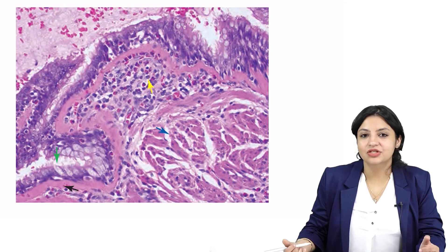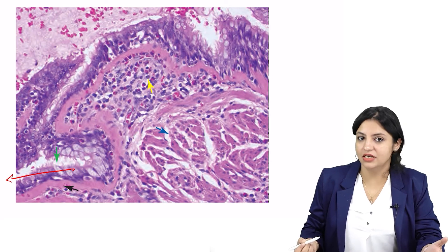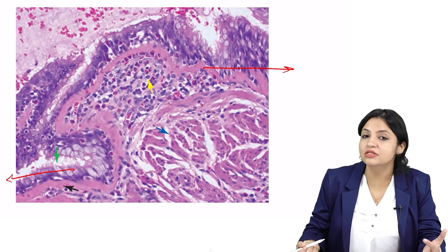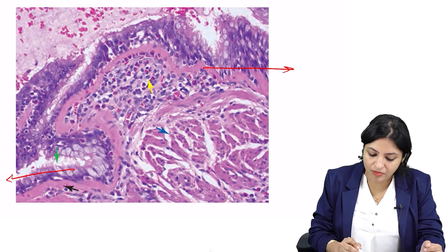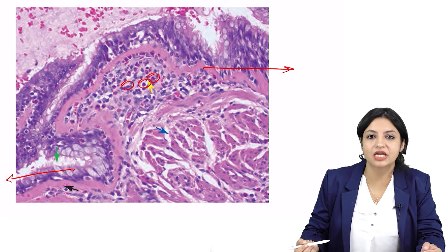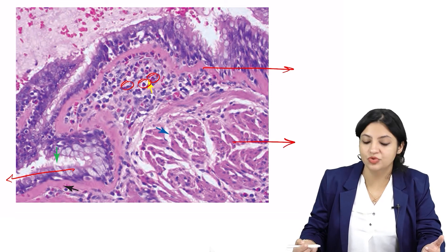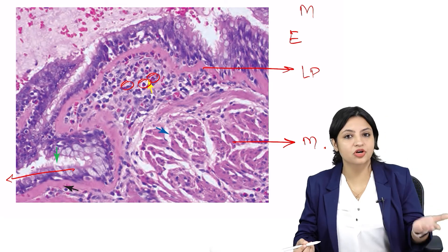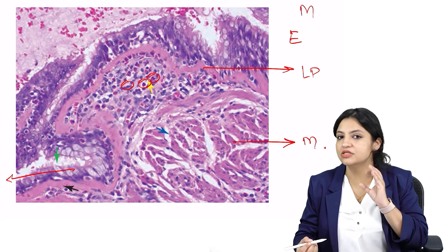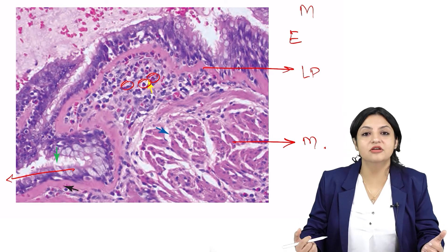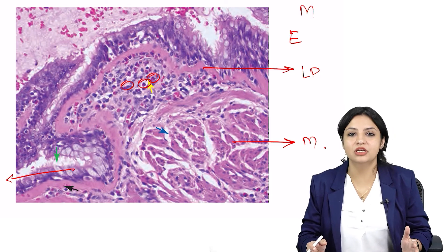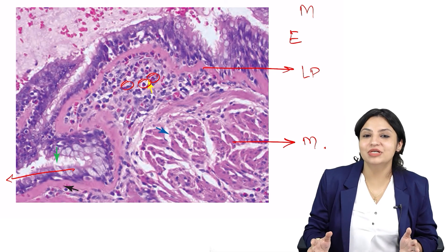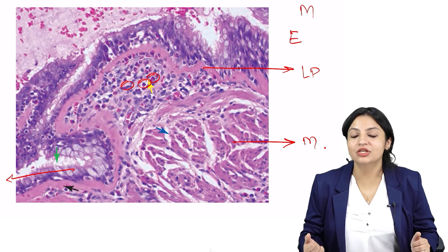Looking at this pathological section: goblet cells are increased, and the basement membrane is so thickened — there is definitely something going on. Look at the lamina propria — can you see the red-colored cells? Those are eosinophils infiltrating the lamina propria. And look at the muscle in the mucosa — muscularis is so much thickened. That is a very characteristic image of airway remodeling, taken from Robbins Textbook of Pathology, the gold standard of pathology. This is airway remodeling occurring in asthma.